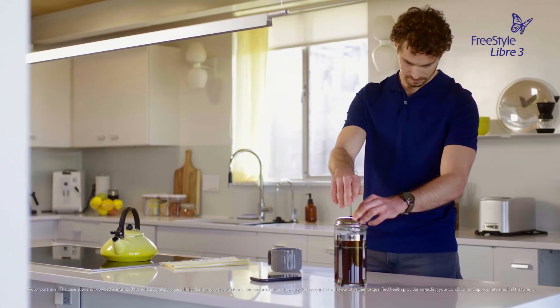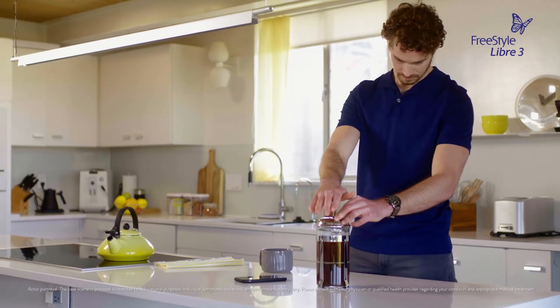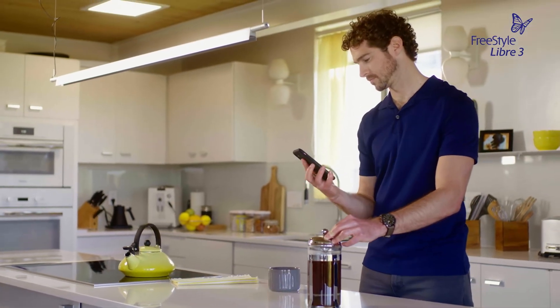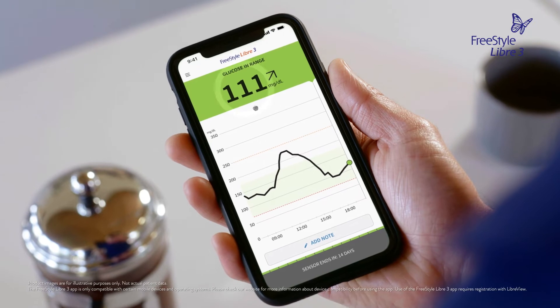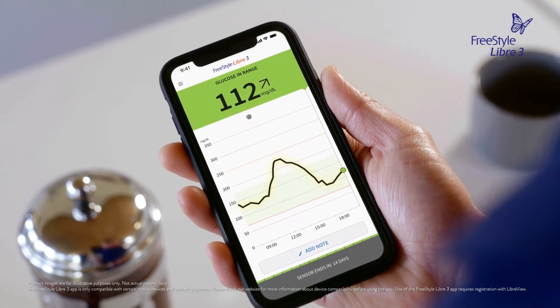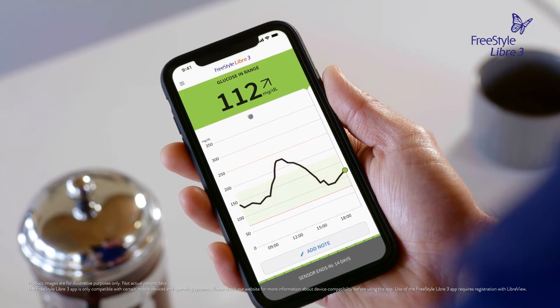What I like most about the Freestyle Libre 3 system is that it's designed to fit into my life. For instance, now I can view my glucose readings right on my smartphone with readings every minute, along with my trend arrow and glucose graph. And setting up the app only takes a few minutes.